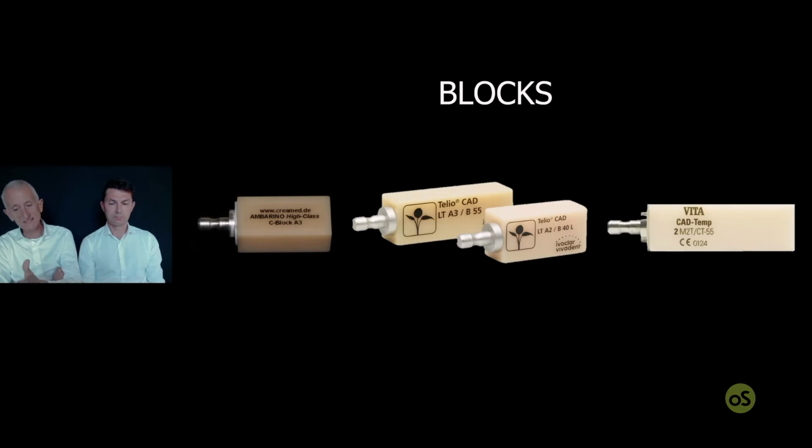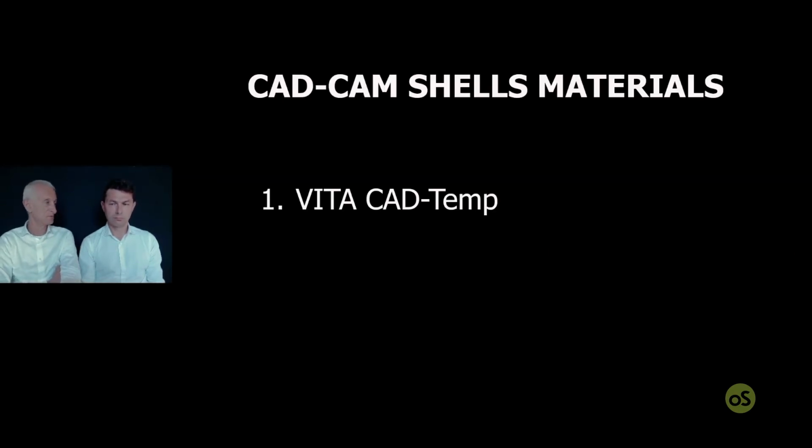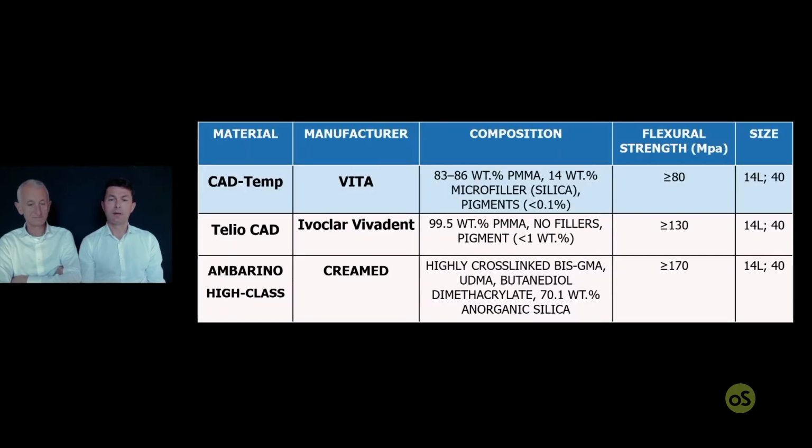Okay, so let's see some of the materials. Maybe you want to present this material or not. Okay, VitaCAD Temp. VitaCAD Temp is a PMMA. Look, the material is 86% of PMMA, and filled the remaining part by the inorganic material.